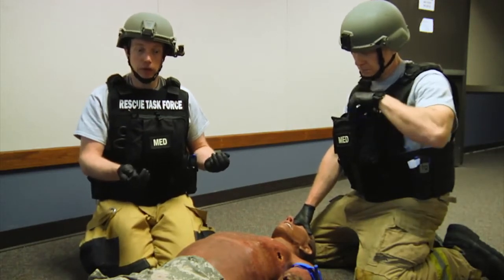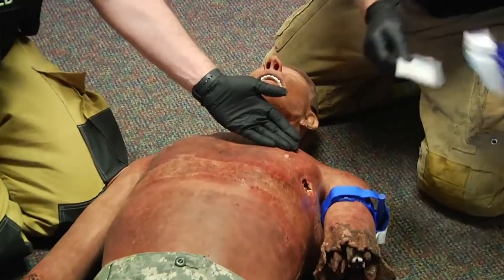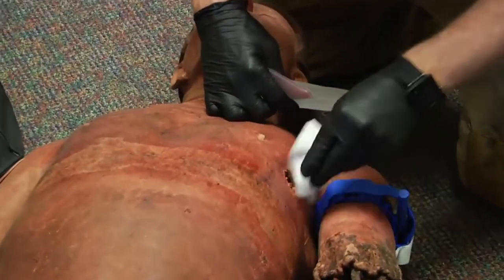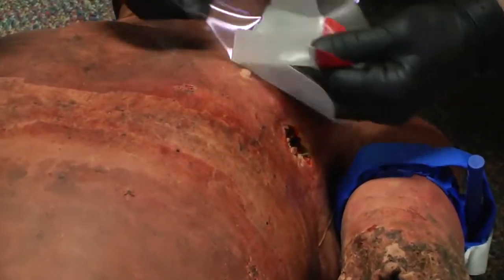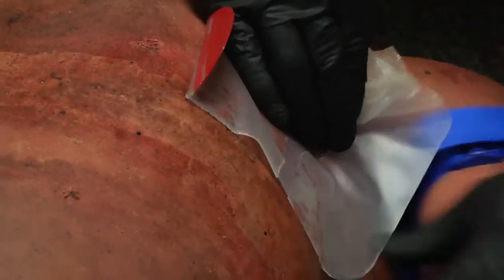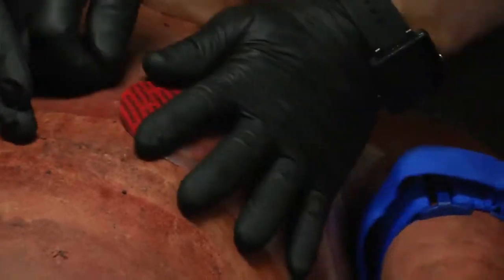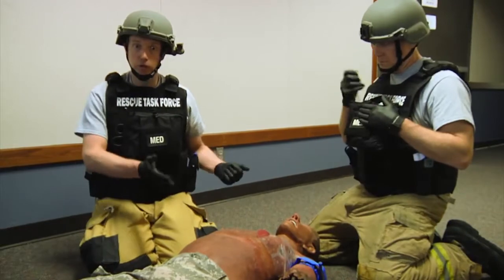The first thing that we want to do as we look at this chest, we can see a wound here that needs to be dealt with. Mark is going to cover that with a vented chest seal. He wipes away the blood at the opening to the wound and places a vented chest seal across the wound. Looking at this chest seal, you can see that there are vents that will allow air to drain out should it need to.